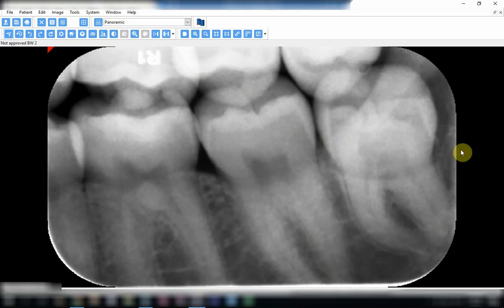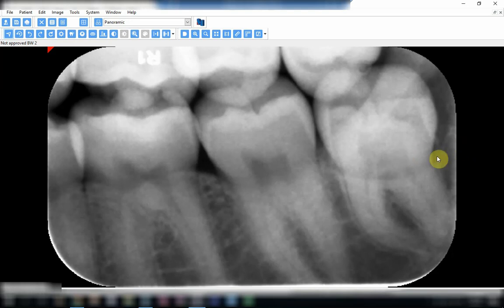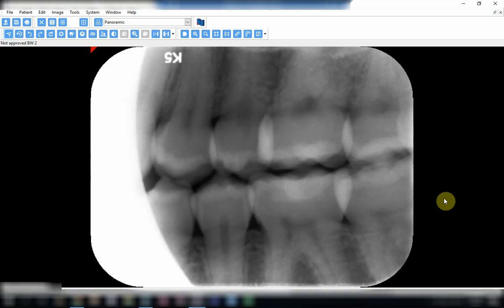We must take care when we place the film. Before we ask the patient to close, we should check that the bitewing tab is set in the middle of the exposure side of the sensor, so that when the patient bites we will have equal coverage of the upper and lower teeth.